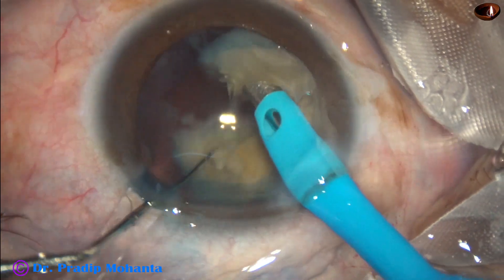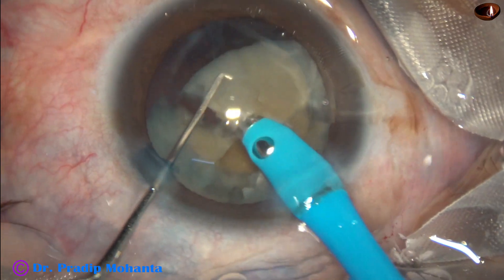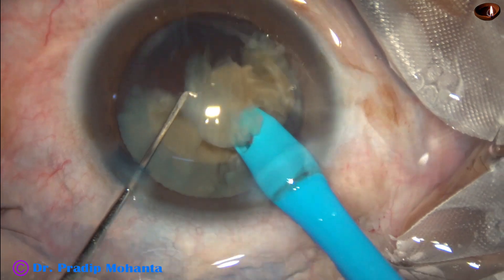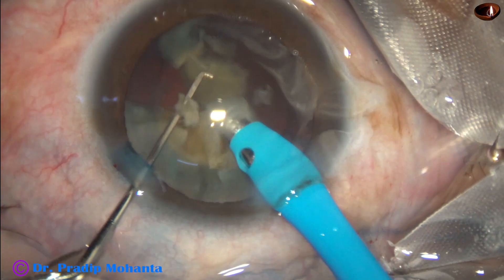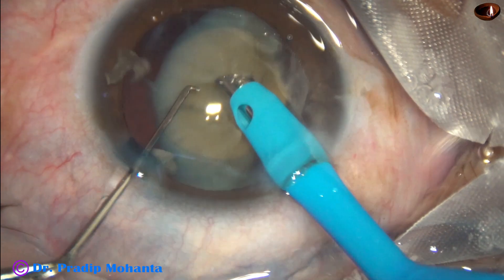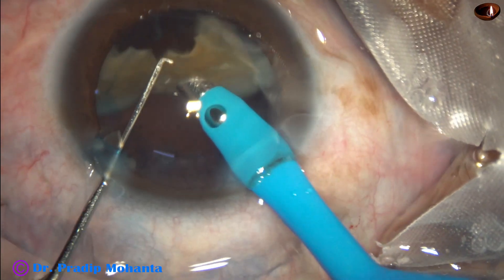Go again into this piece and divide it. Now this piece is free. Bevel is sideways and emulsification is carried out. Ultrasonic energy used is 80 percent, flow rate is 45 ml per minute, and vacuum is 450 millimeters of mercury.